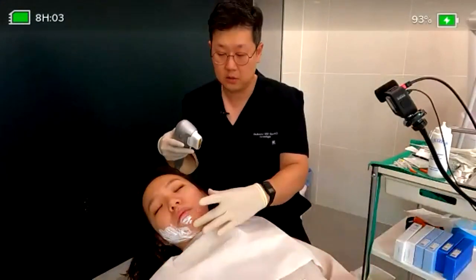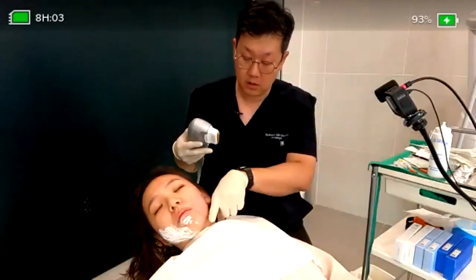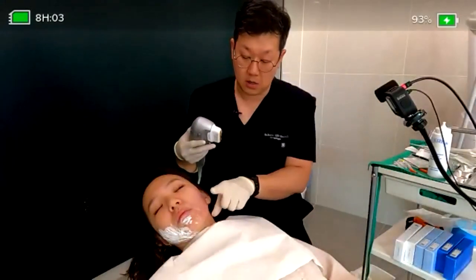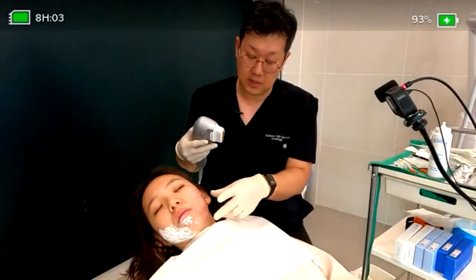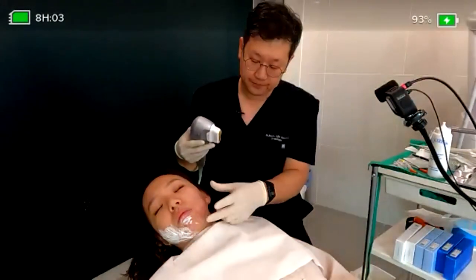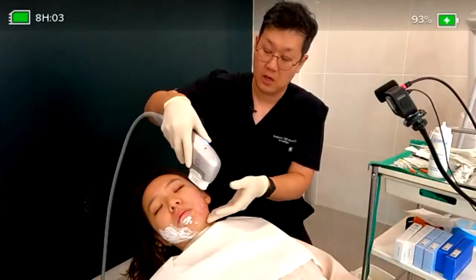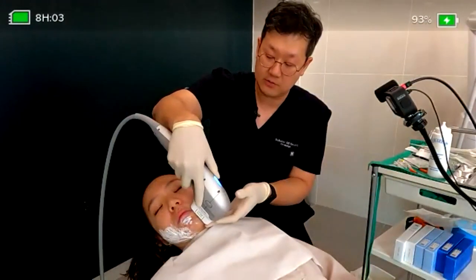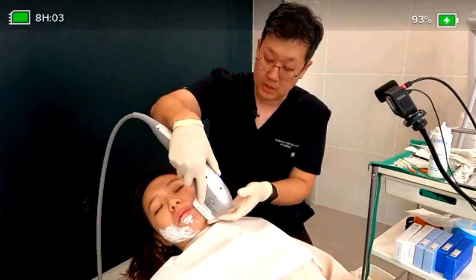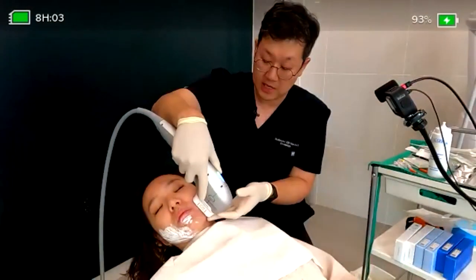Usually using this, I think you can see that I have a 1 finger length on my own. It's around 9 centimeters, sorry, and you can see that for these sections, with the 3 millimeter first, you will go for 50 to 70 lines first. Are you okay? I'm just asking her if she's okay, and she answered she's okay.